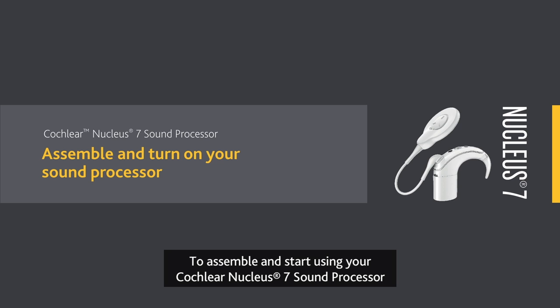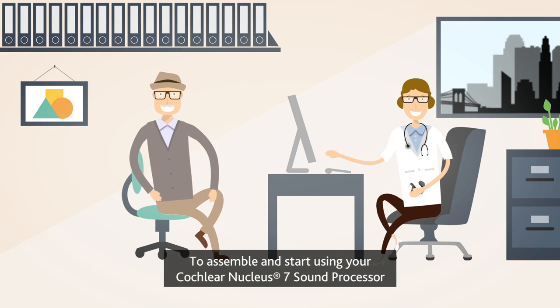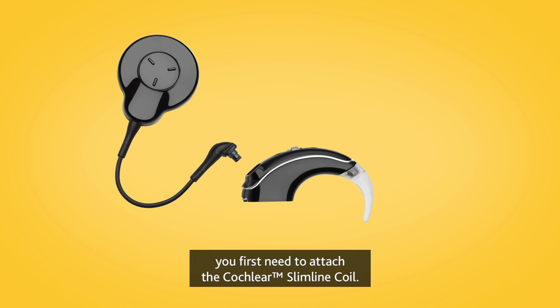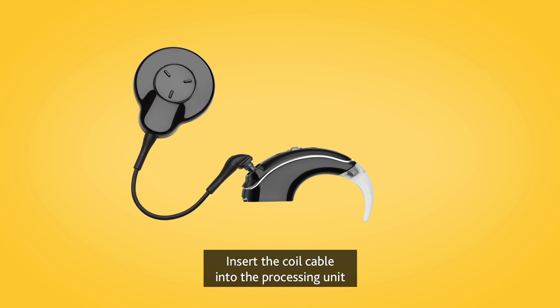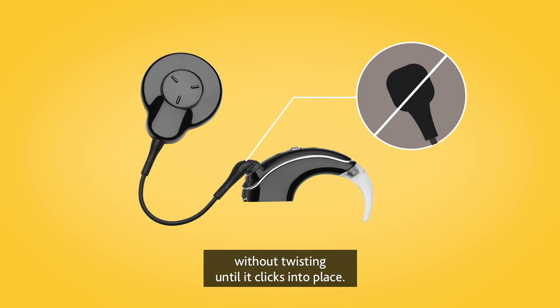To assemble and start using your Cochlear Nucleus 7 sound processor, you first need to attach the Cochlear Slimline coil. Insert the coil cable into the processing unit without twisting until it clicks into place.